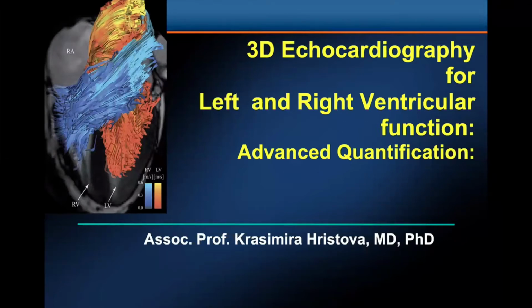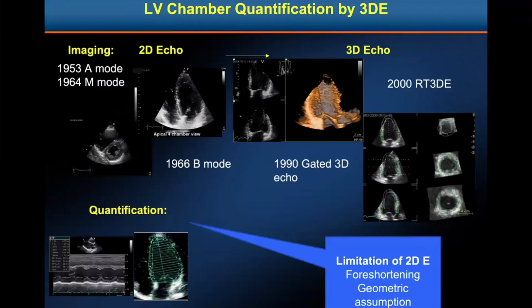I would like to share some of my opinion about 3D echocardiography for analyzing the left and right ventricle function and advancing quantification, because this is a big topic, and I will show some of the tools that it's possible to introduce.